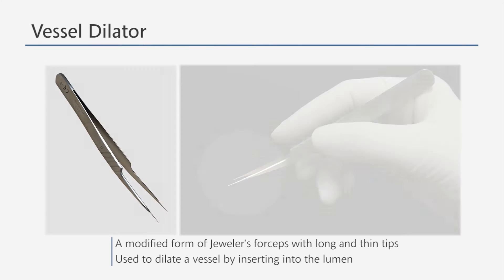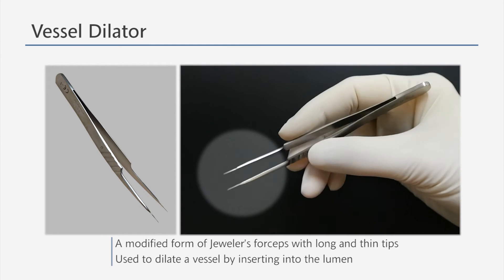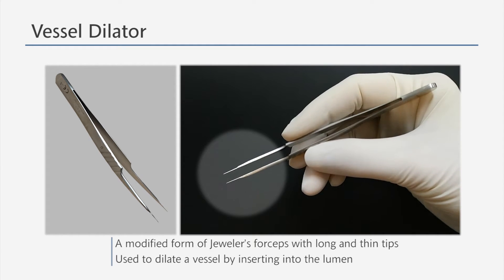A vessel dilator has thin and long tips that are designed to be atraumatic. It is inserted in the vessel lumen to dilate the vessel or to behave as a source of counter-direction when suturing.